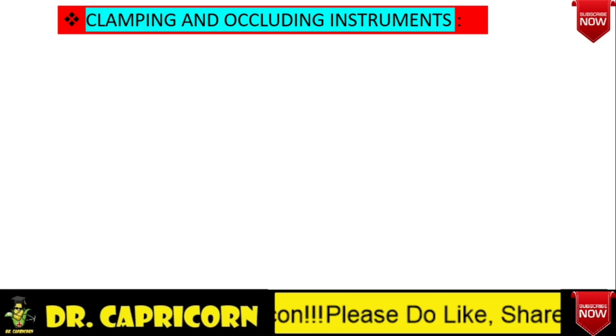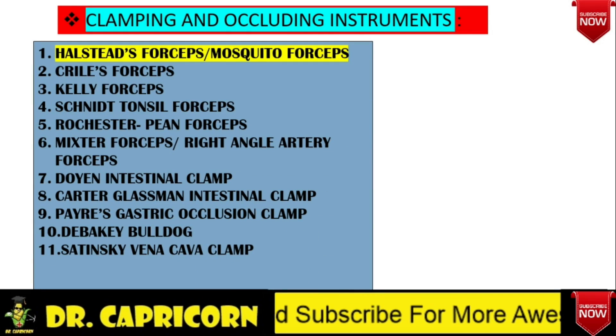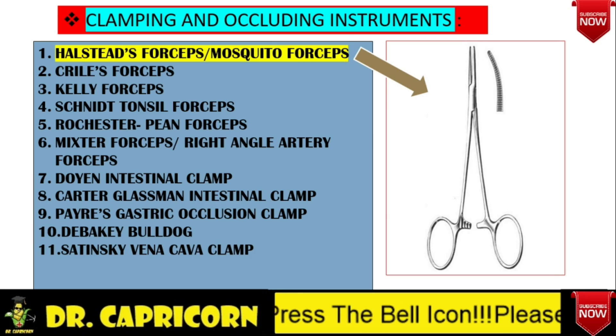Now let's start our discussion with instruments one by one. Firstly, let's discuss the instruments which are used for clamping, including any tubular structure or arteries. In this section we will learn about mosquito forceps, Crile's forceps, Kelly forceps, Rochester PN forceps, right angle artery forceps, Doyen intestinal clamp, Carter Glassman intestinal clamp, Payer's gastric occlusion clamp, DeBakey bulldog, and Satinsky vena cava clamp. This is how mosquito forceps looks like — please note the transverse serrations and small blade size.